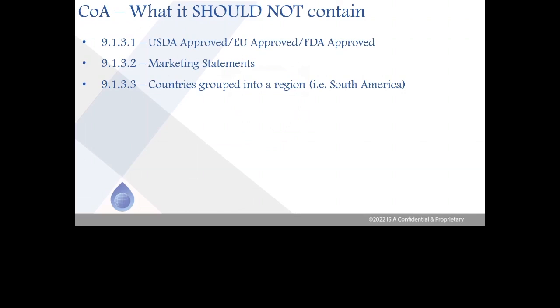Countries grouped as a region. If blood is pooled from multiple countries, then all countries should be reported. A couple examples of grouping countries together into a region are presented below.